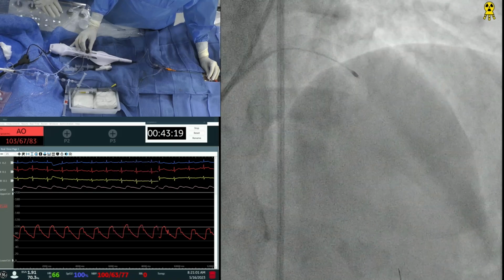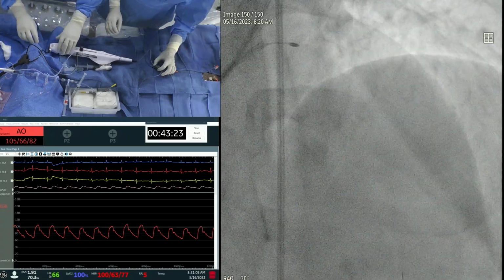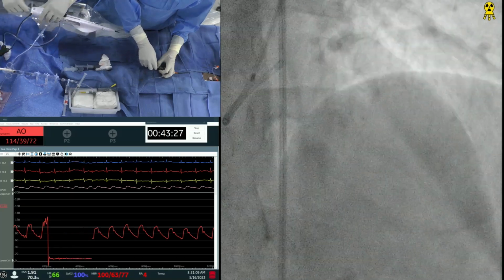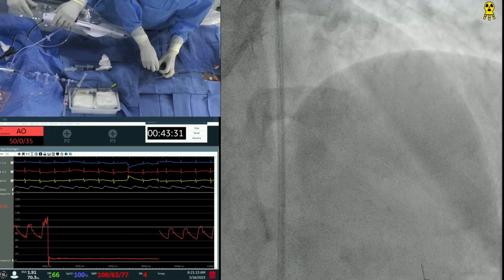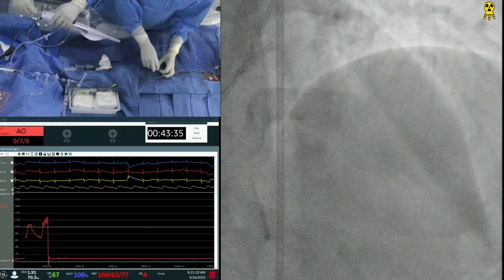You going to the third lesion also? No. Yeah. Right here. Good. I think the third region we don't touch. Good. Okay. Yeah. Now get me a run through for the LAD and then I'll try to wire the diag. No, excellent demonstration of the rotablator.